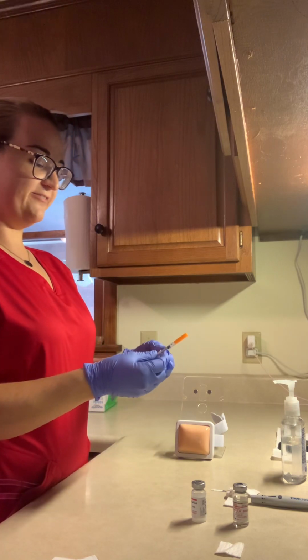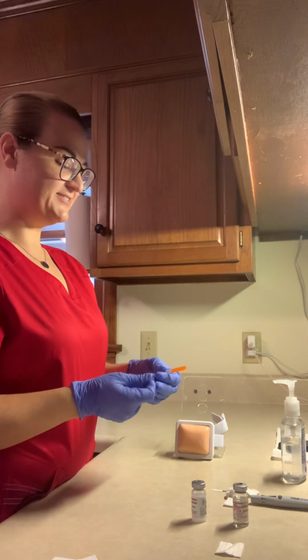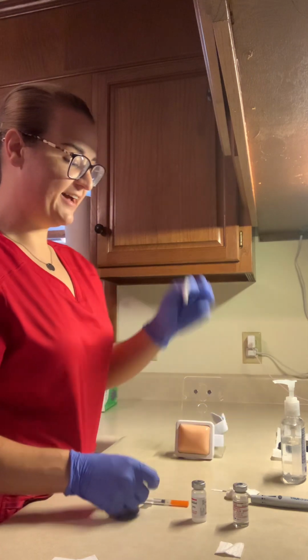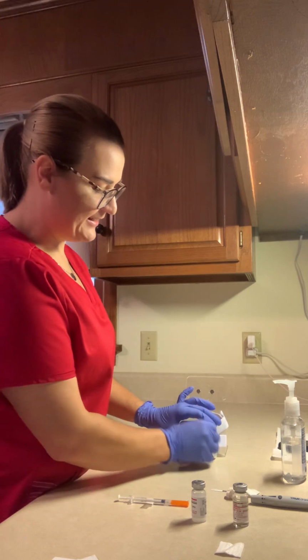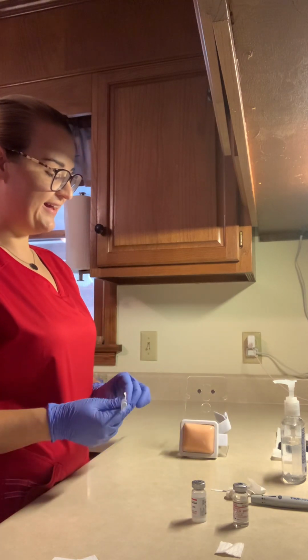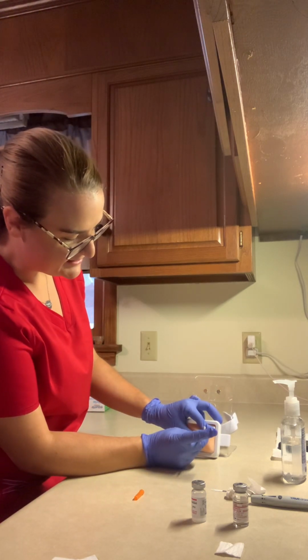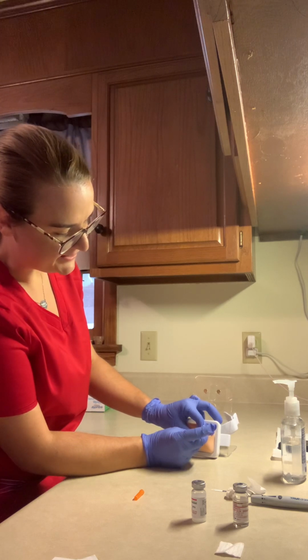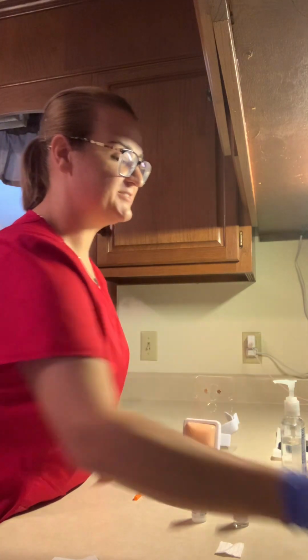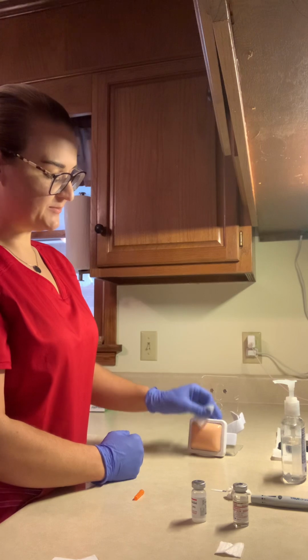And at the bedside, I verify on my ID marker, this is 10 units with my MAR. He receives 10 units, 5 units each of NPH and regular-acting insulin. I will take a clean alcohol swab, clean the site in which I'm injecting, allow it to dry completely, uncap the needle, pinch the skin together, inject the syringe at a 90-degree angle, inserting the medication slowly, withdrawing and disposing of my syringe in a biohazard sharps container. I will place the alcohol pad back on top just to make sure there's no medicine that comes out and he's not bleeding.